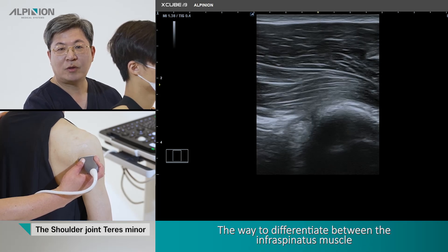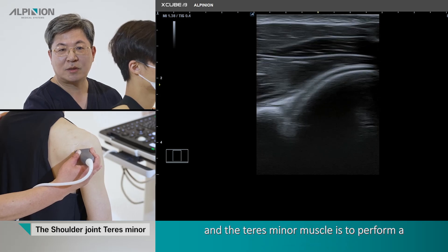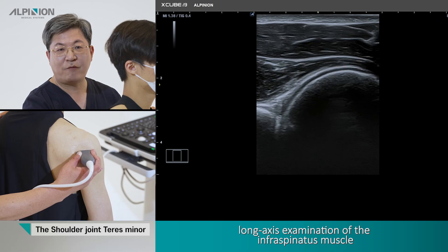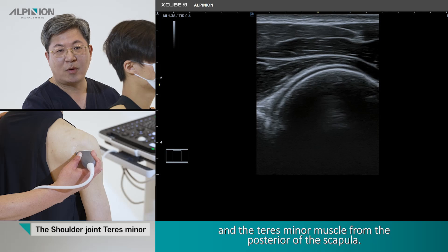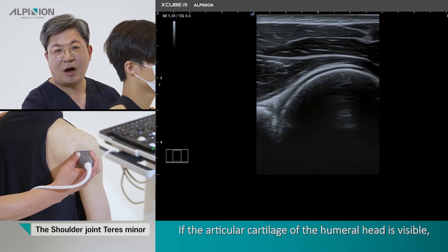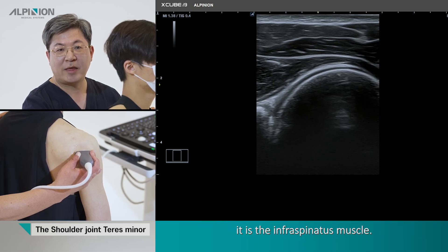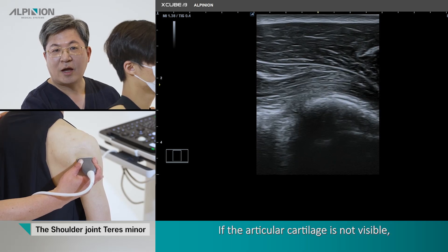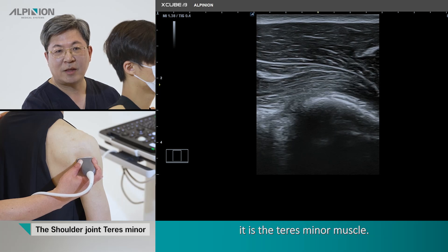To differentiate between the infraspinatus muscle and the teres minor muscle, perform a long axis examination of both muscles from the posterior aspect of the scapula. If the articular cartilage of the humeral head is visible, it is the infraspinatus muscle. If the articular cartilage is not visible, it is the teres minor muscle.